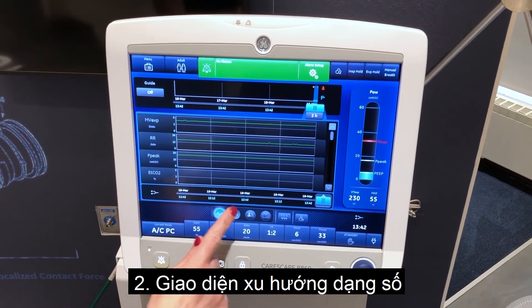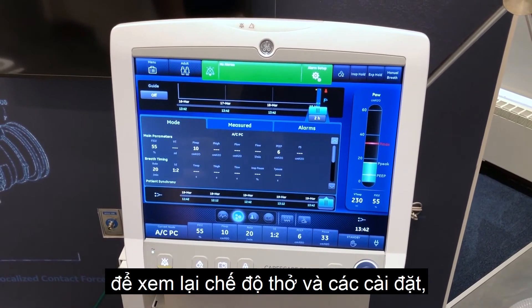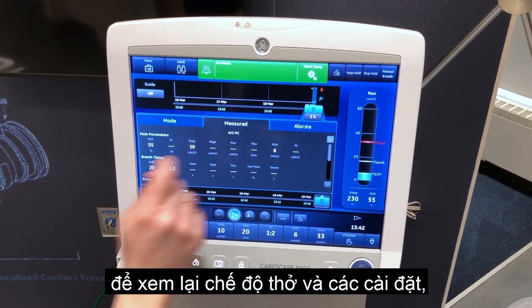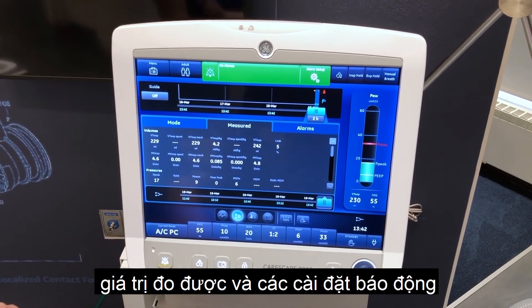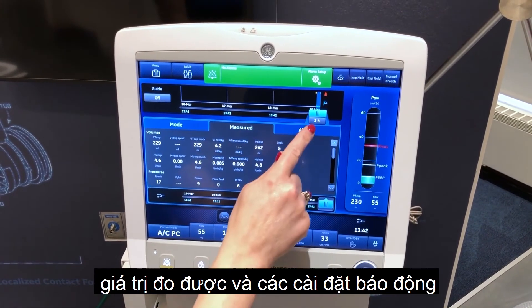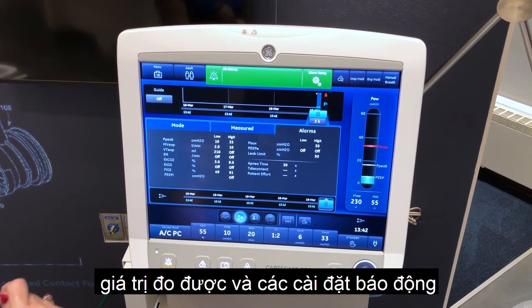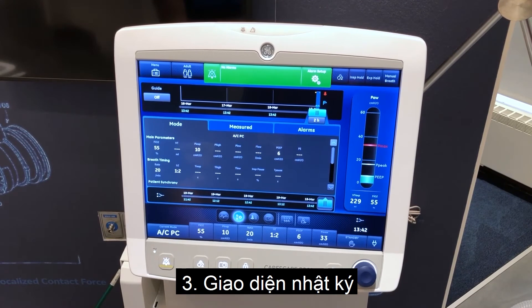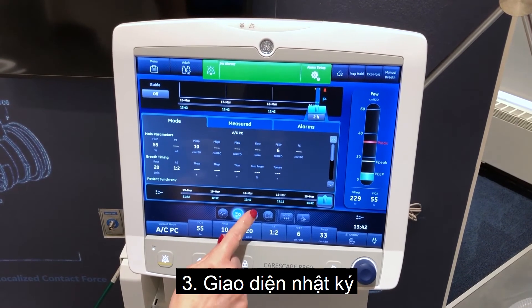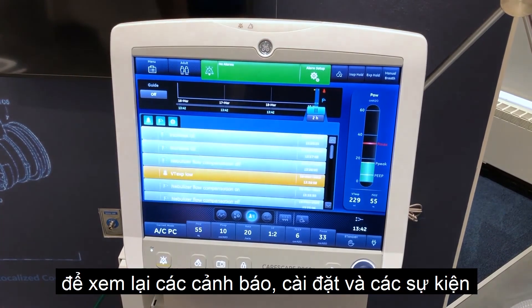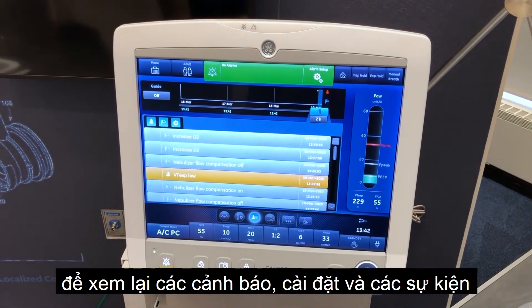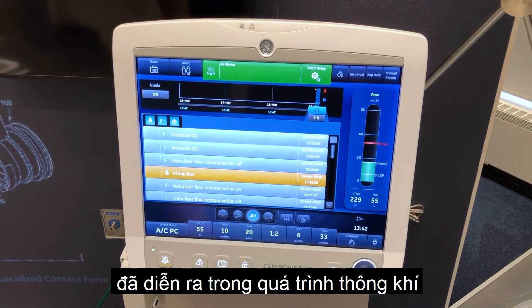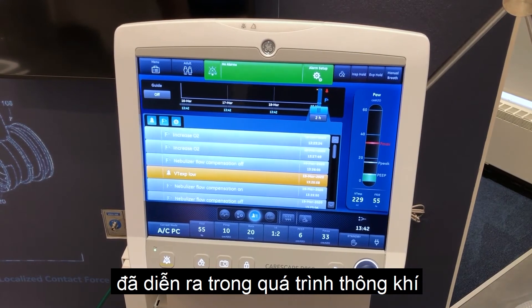Numerical trends view to review patient ventilation modes and settings, measured data, and alarm settings. Trends log view to review patient alarms and settings, and events that have occurred during ventilation.